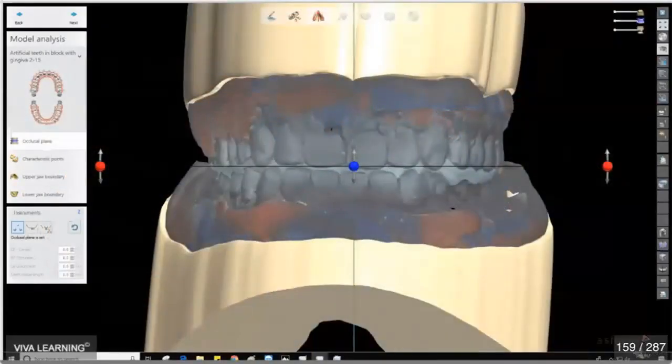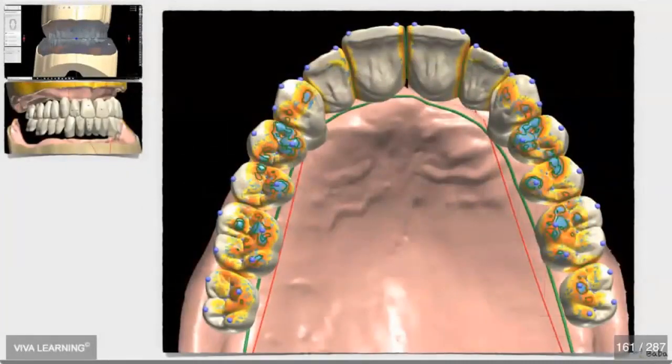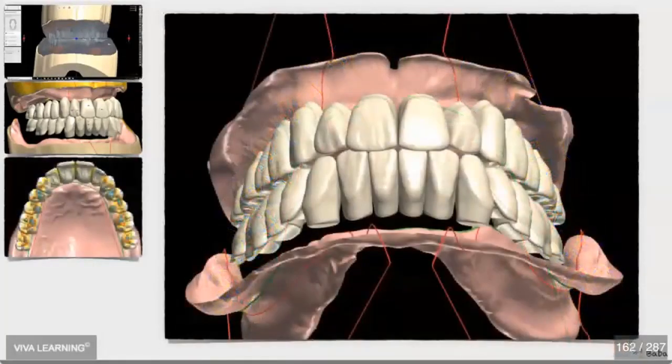So when he puts everything in the computer, you notice that there's a marker here that he sets close to or just on top of the midline that I have provided, the new midline. Then the teeth are set, and the occlusion is worked out very delicately. Then we go over every single tooth, make sure that the contacts are there and the dentures are balanced. And then here, you can evaluate the overjet and the overlap.